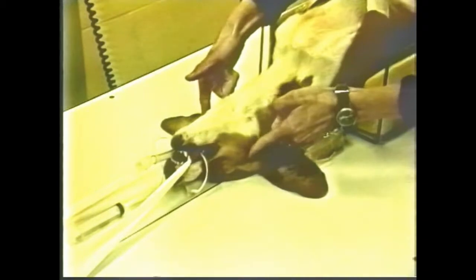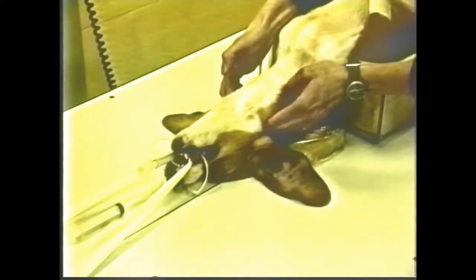The control of the neck is primarily by accomplishing the proper positioning of the head and the thorax. The animal in this case is in a V tray, which assists in positioning the thorax properly, and then with the tape on the canine teeth, the head can be positioned in a proper VD fashion. The ears must be pulled out so that they are not underneath the cervical vertebra.